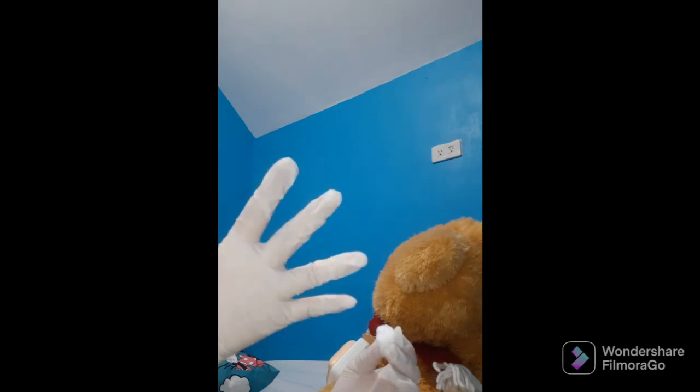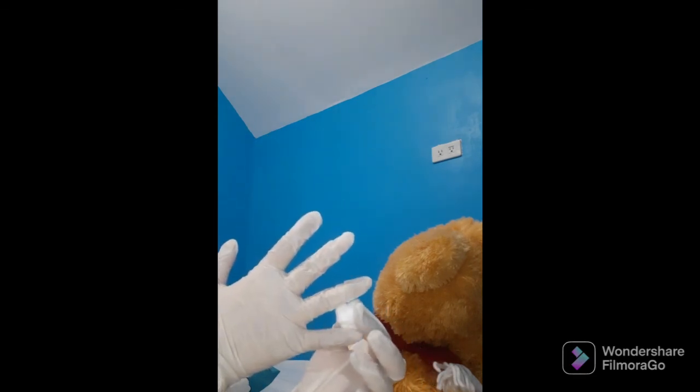Okay. And then after that, discard. And we need to place and hold the swab between the third and fourth fingers of my non-dominant hand, or position the swab on the client's skin above the intended site. So, ganyan po. And next is we need to prepare our syringe for the injection. So, we remove the cap. So, i-remove po natin yung cap while waiting for the antiseptic to dry. Need to dispose yung ating needle cap.